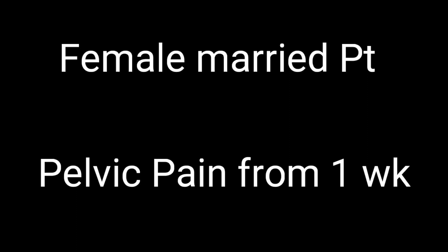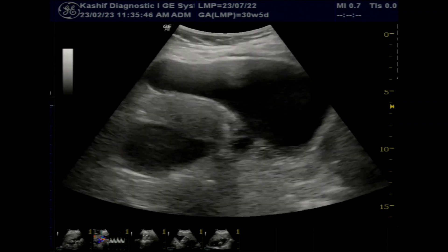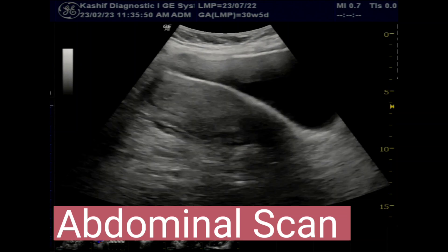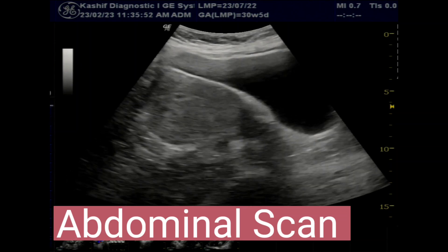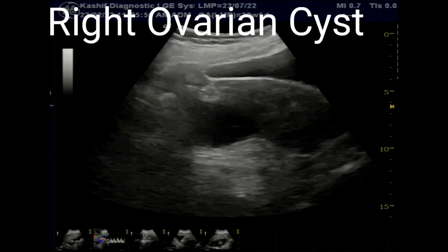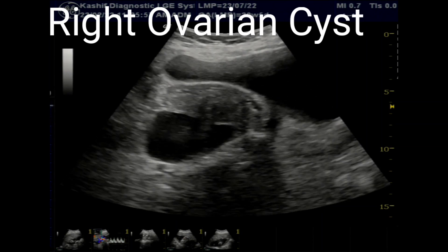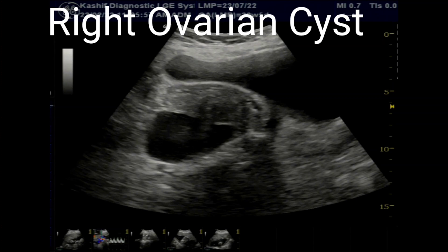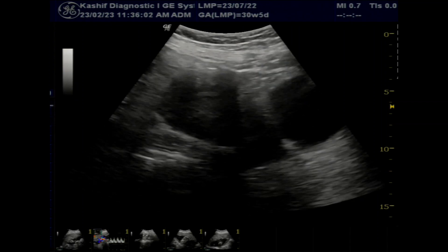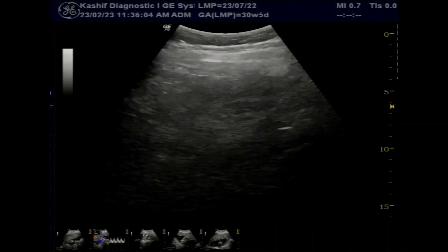This is a patient, 28 years old, with history of pelvic pain from one week. Abdominal scan is done and shows a right ovarian cyst, posteriorly placed. The cyst appears simple from the abdominal approach. The uterus is enlarged and there is an intramural fibroid, posteriorly placed, but the uterus is not the cause of the pain.